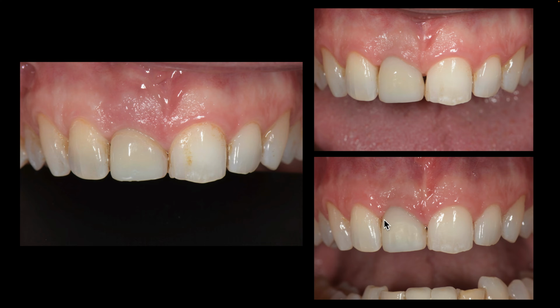So you do this by adding flowable composite on the provisional, subgingivally, and it can basically reshape the gingival levels by pushing the gingiva up with the additional provisional flowable material. So that's how we do that.